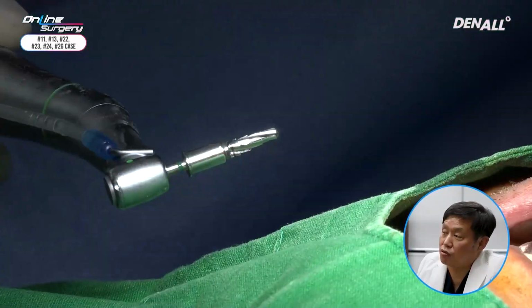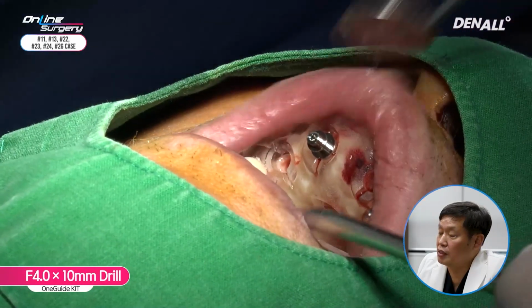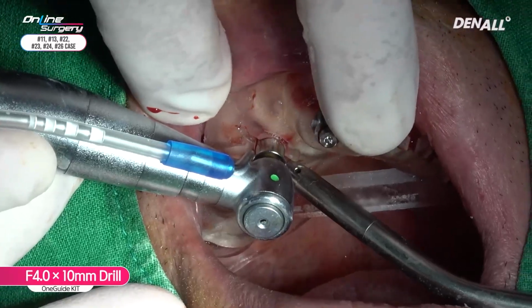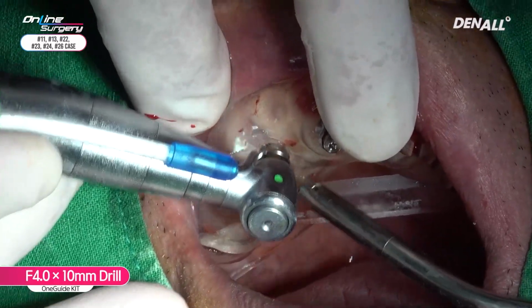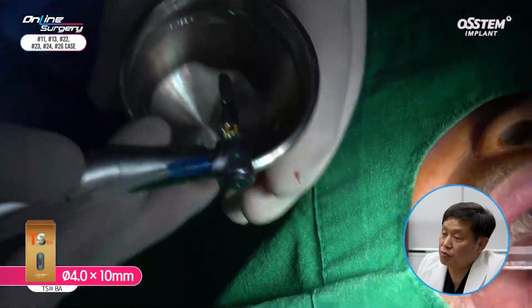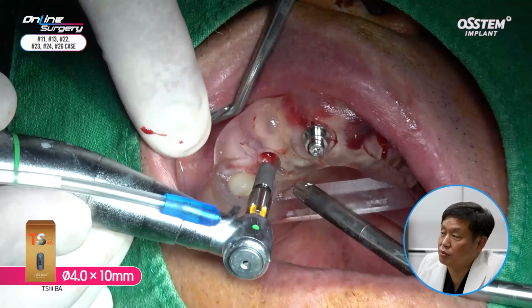The template was nicely fixed. Next is the 4.0 by 10 mm OneGuide drill. In number 13, a TS3 BA surface 4.0 by 10 mm implant was placed.